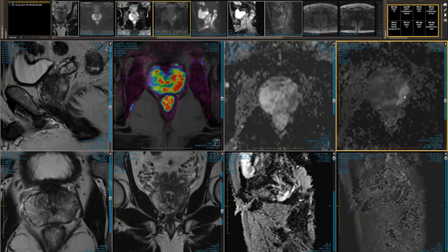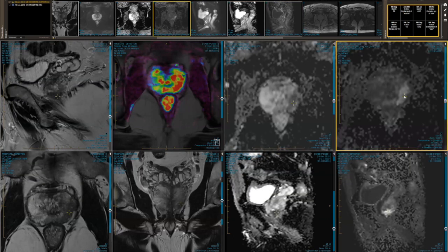For time reasons, we haven't done sagittal diffusions, and I think you're probably the only unit that we've seen that do. So it'd be really interesting to hear Richard's view on the sagittal. And I know it's like all things, when you start doing sequences, you realize how good they are. For us, probably we wouldn't have time to add that.